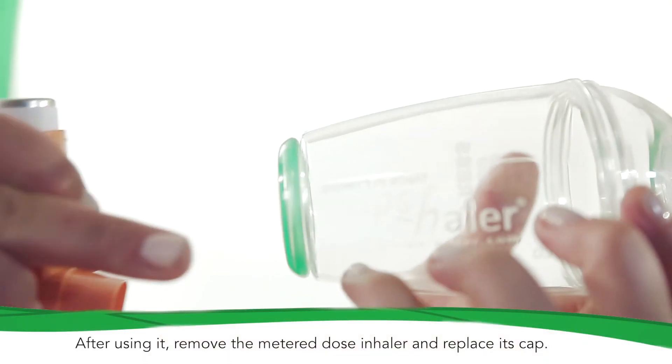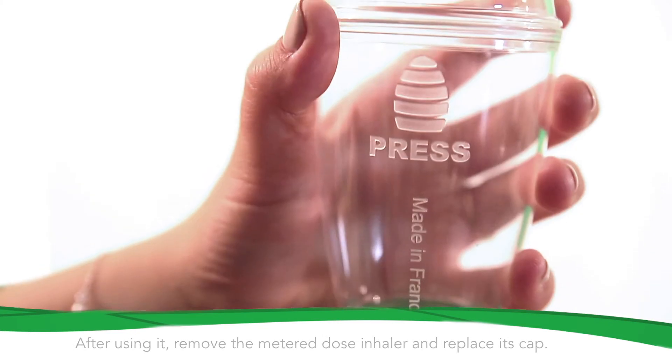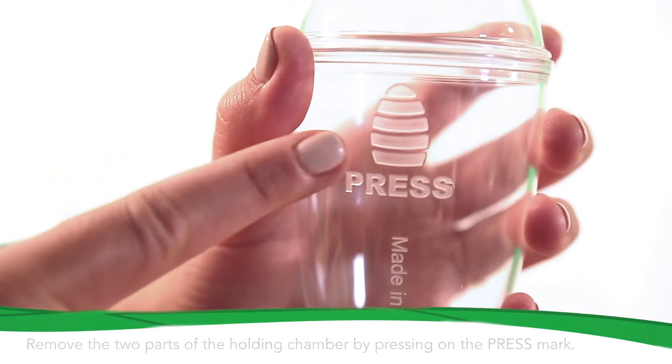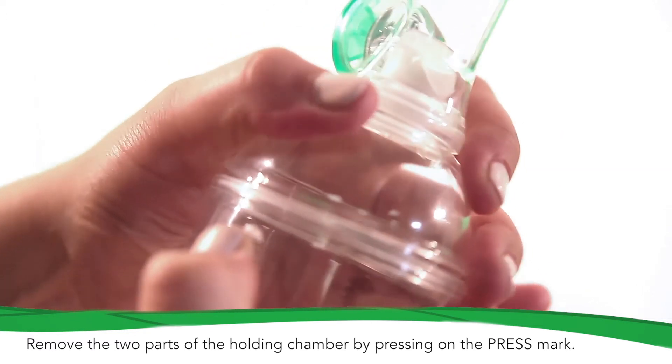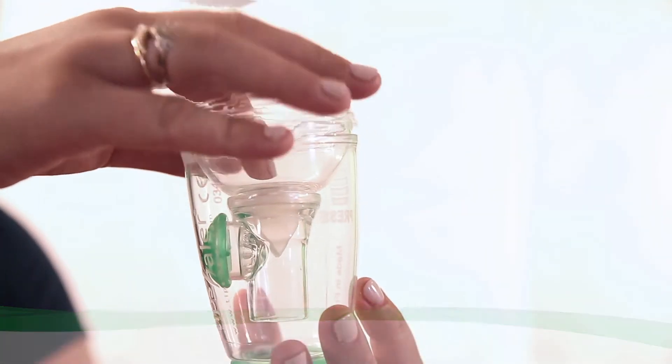After using it, remove the metered dose inhaler and replace the cap. You can store Tipshaler in its box. Tipshaler must be washed once a week according to the instructions of use.